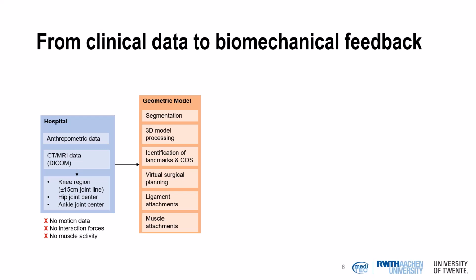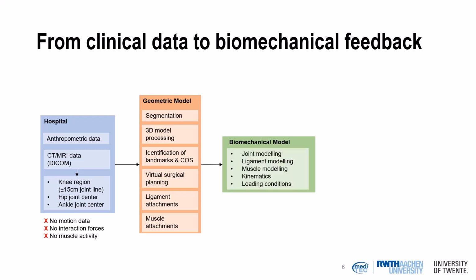Then we can identify landmarks, bony landmarks, and anatomical coordinate systems, which is then often the basis for virtual surgical planning. So we define the cuts, the leg axis, and already virtually insert our implants. But we can also identify ligament attachments and muscle attachments based on a priori knowledge, which is also then part of this webcast.